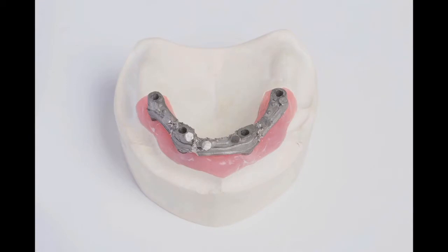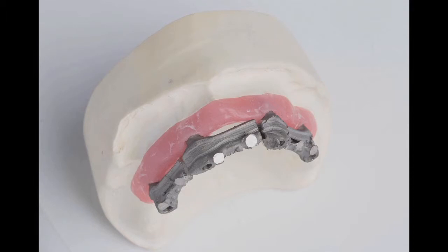Cast metal bars have traditionally been used in fixed removable implant cases as a solution to increase the strength of an acrylic prosthesis and more evenly distribute load-bearing forces across the implants.